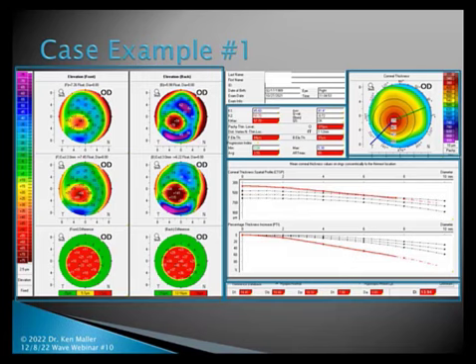And that's actually the total deviation. And since you don't know what the norms are, a value of 1.6 would be suspicious, and a value of 3.0 is abnormal. So clearly a total deviation of 13.94 is very abnormal. So again, this is a very, very clear-cut case that we have keratoconus.